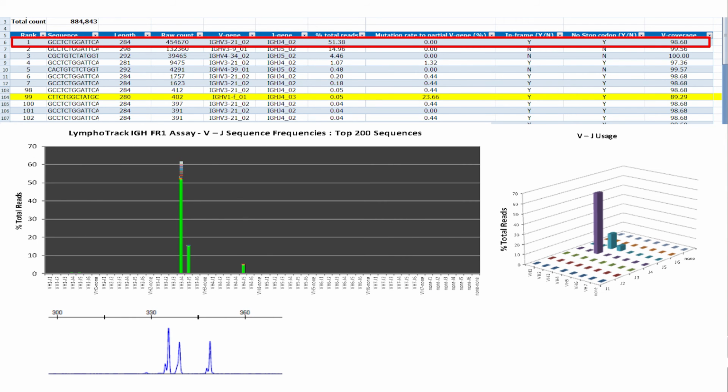So what you can see here, this is that last example. You can pick up the clones that we were intending to look for, but then in here is the CAR T cells that are now at very, very low frequency, about 0.05%, but they're still there.